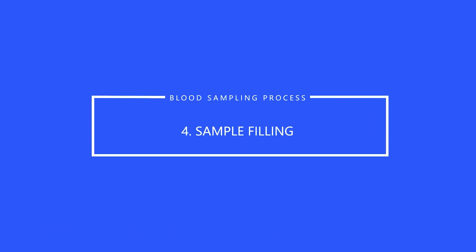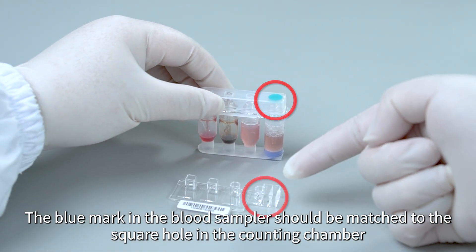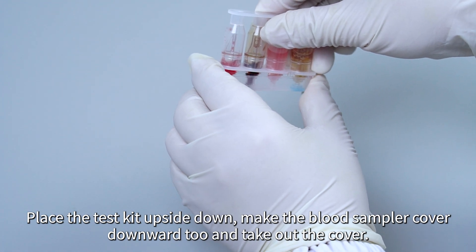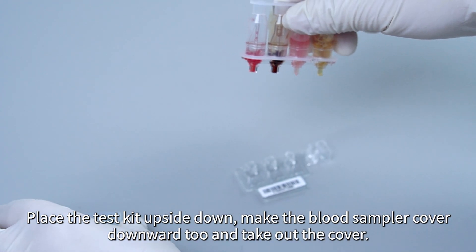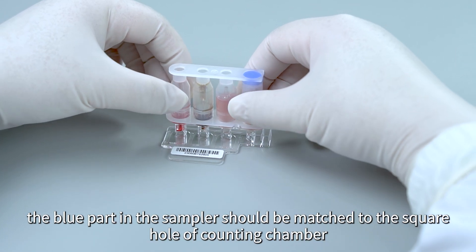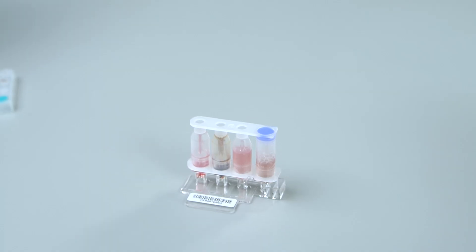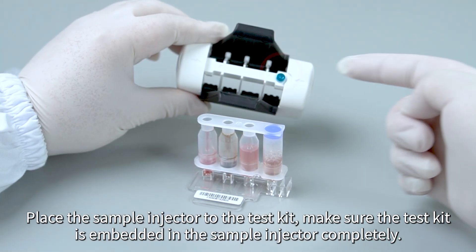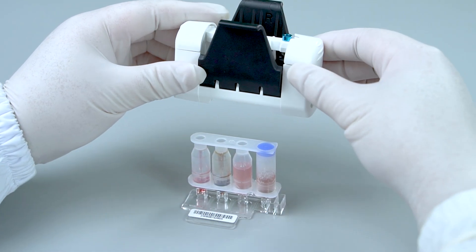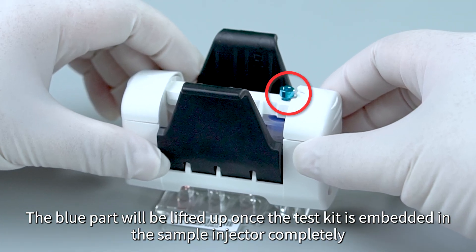Sample Filling. The blue mark in the blood sampler should be matched to the square hole in the counting chamber. Place the test kit upside down. Make the blood sampler cover face downward and take out the cover. Then insert the test kit into the counting chamber slightly. The blue part in the test kit should be matched to the square hole of the counting chamber. Place the sample injector onto the test kit and make sure the test kit is embedded in the sample injector completely.